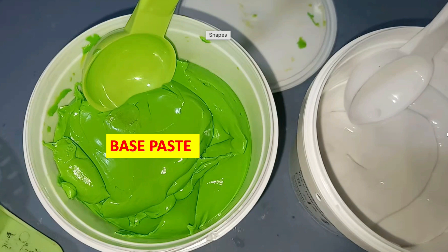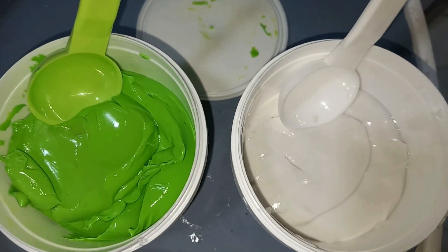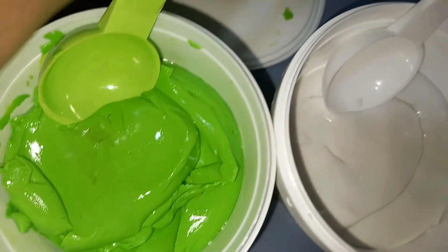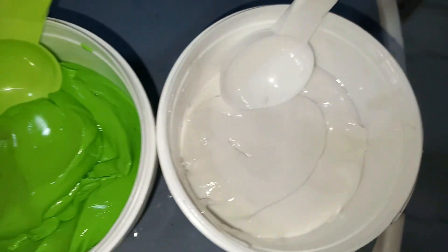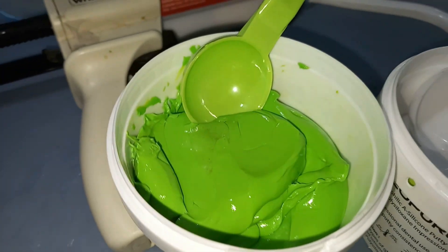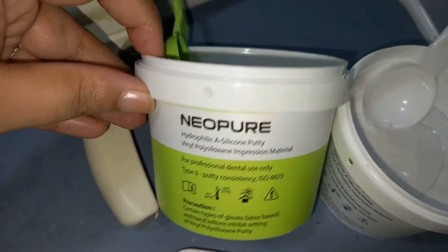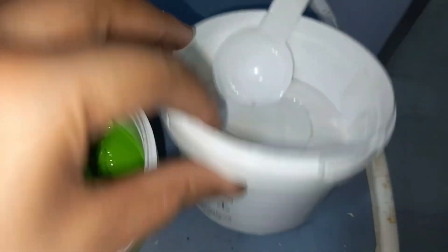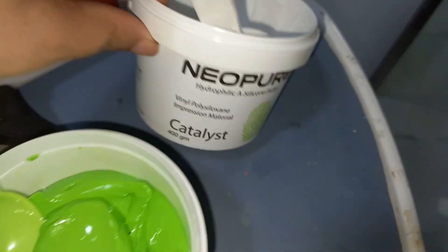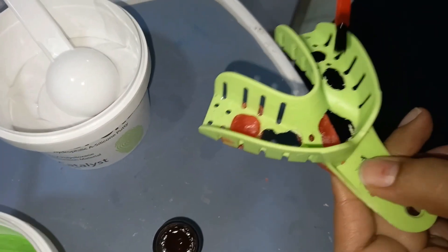In the single step technique, the base paste and the catalyst of the putty material are mixed in the ratio as recommended by the manufacturer. The one in green is the base paste and the one in white is the catalyst. They are available with spoons — the green spoon is for base paste and the white spoon is for catalyst.